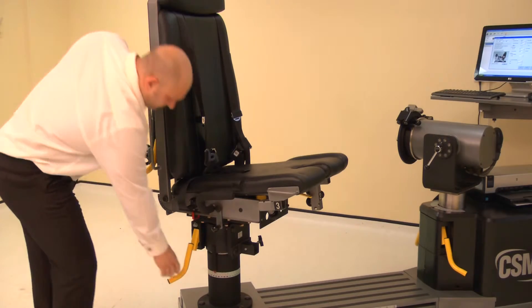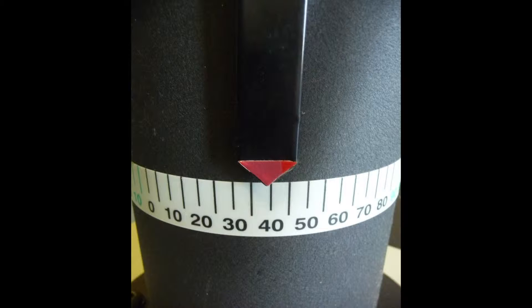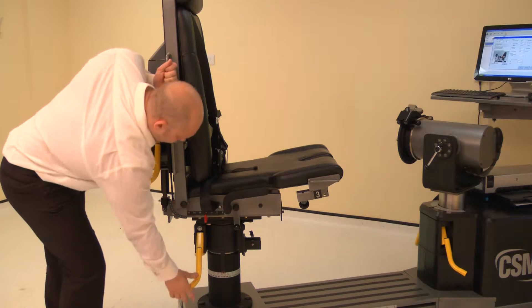Now adjust the chair rotation. Lift the locking handle and rotate the chair. For the right knee, rotate the chair to 40 degrees on the black scale. Ensure both locking handles are pushed down to secure.